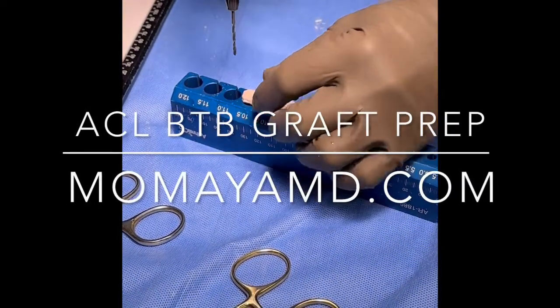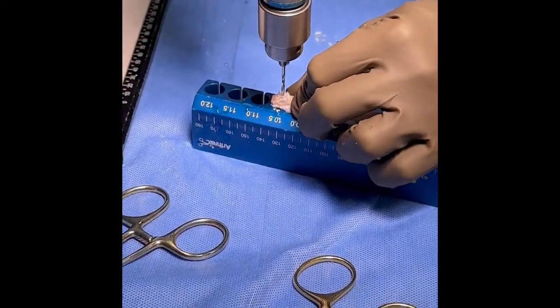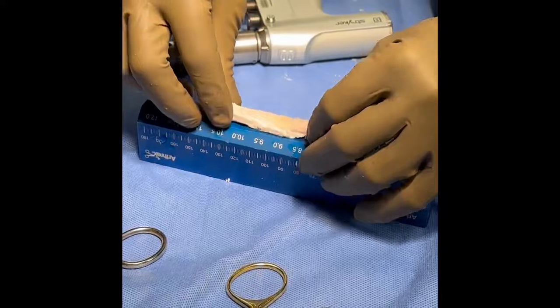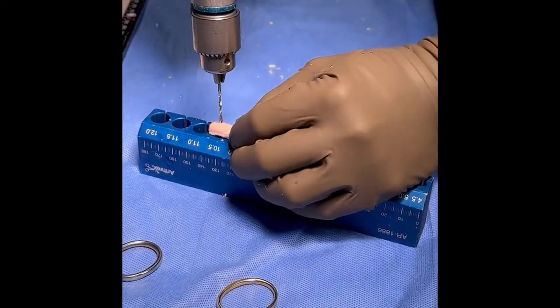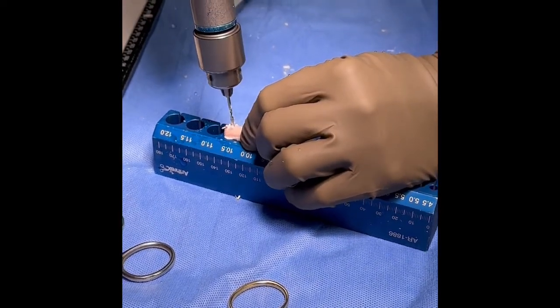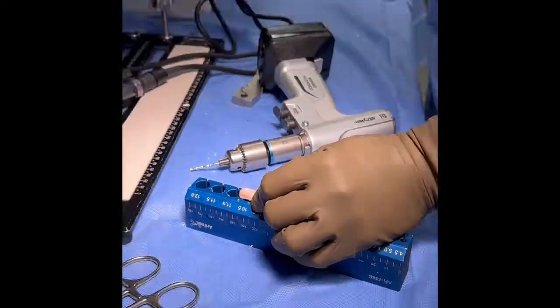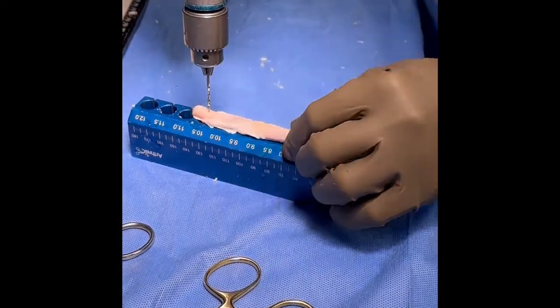When preparing an ACL-BTB autograft, we typically use a 2mm drill bit to drill holes on both bone plugs. We drill one hole on the femoral side and two drill holes on the tibial side. Notice how the drill is changed to oscillate when it passes through the patellar tendon side, so as not to wrap up the tendon. Be sure to space out the drill holes appropriately.